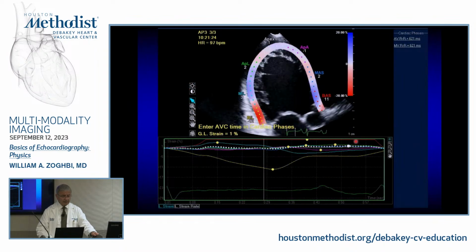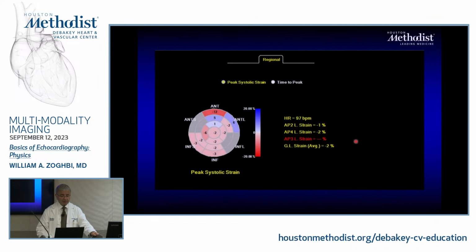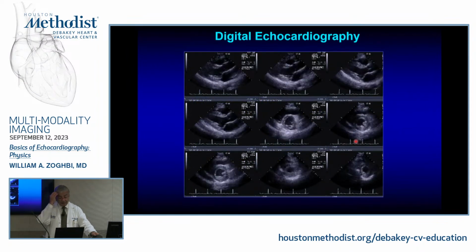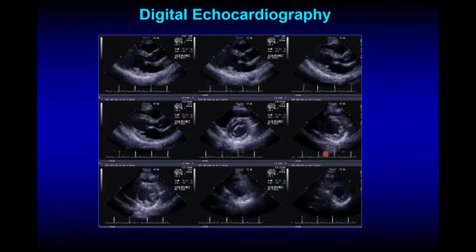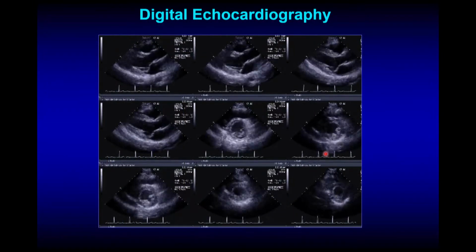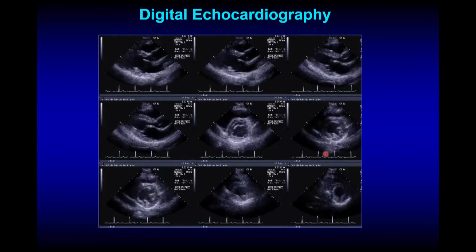But I think it really is a very quantitative index nowadays that can add to your measurement of function, of ejection fraction, etc. Digital storage you don't have to worry about because it's already available for you. The beauty of digital storage and previews like this is, remember, if you're going to go and measure, I want to pick the one that is less foreshortened, right? I want to pick, so it is the availability of multiple of these.